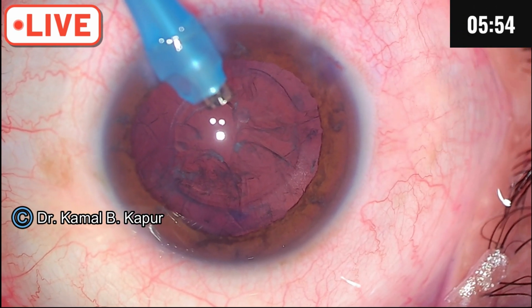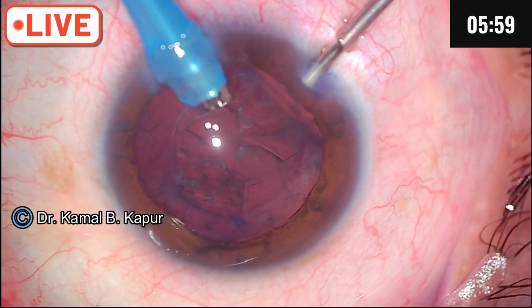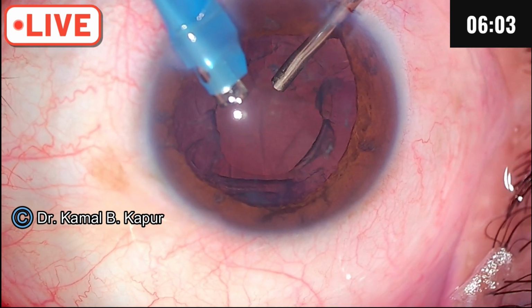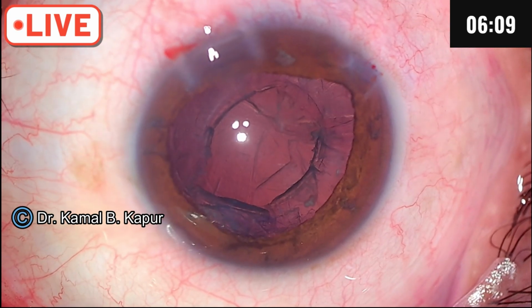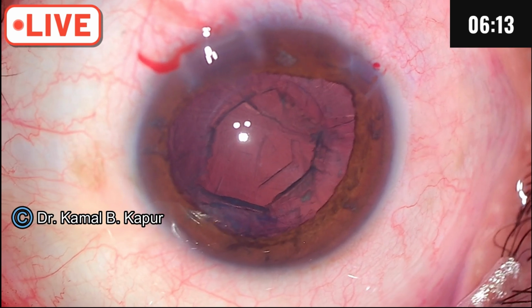Visco is ready. Now we will actually introduce the visco into the bag. This doesn't have to go into the anterior chamber. You notice I am pushing it into the bag, and do not over pressurize it. Now this distends the bag in an angle. Now we will go in for placing a CTR.